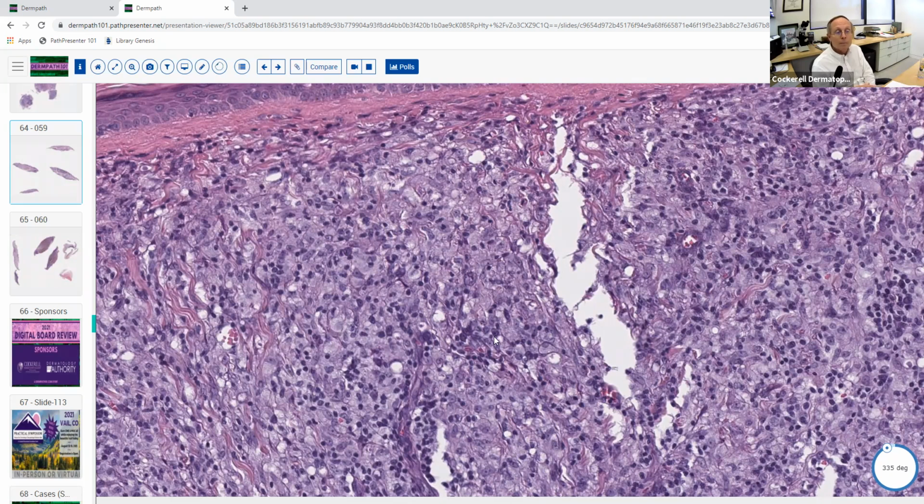So this is probably polar lepromatous leprosy, not borderline. It would be polar lepromatous, multibacillary, with millions and millions of organisms in a patient like this. A PAS stain, well, no, that again is a stain for fungi. And finally, a Giemsa stain doesn't really stain Leishmania. It makes the Leishmania organisms a little more visible compared to the background cytoplasm of the cells they're in. I've never used a Giemsa stain for that diagnosis because you see the organisms with H&E; you don't really need it. That's the use of it for that purpose.